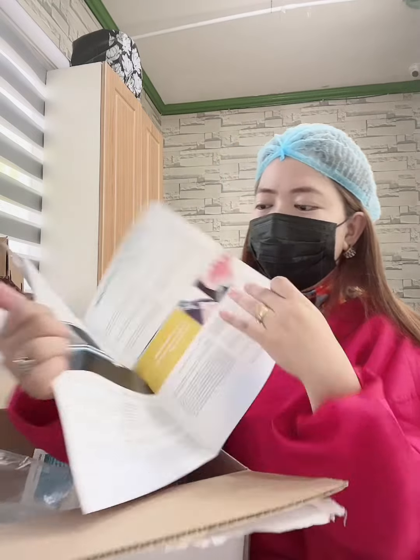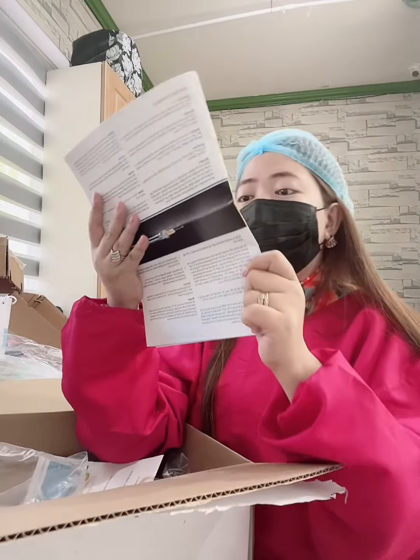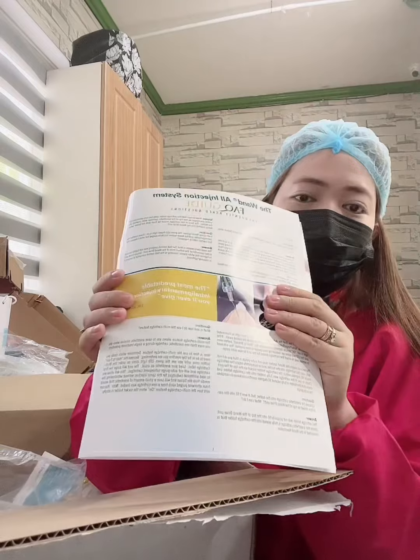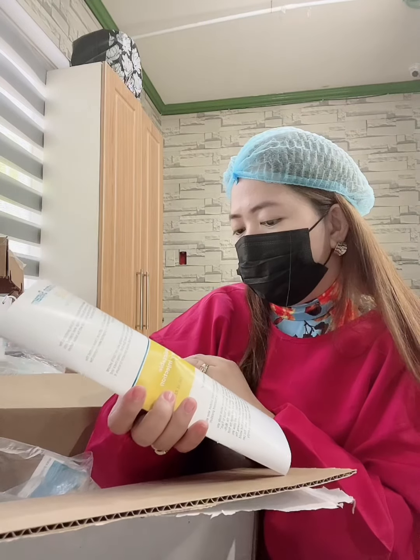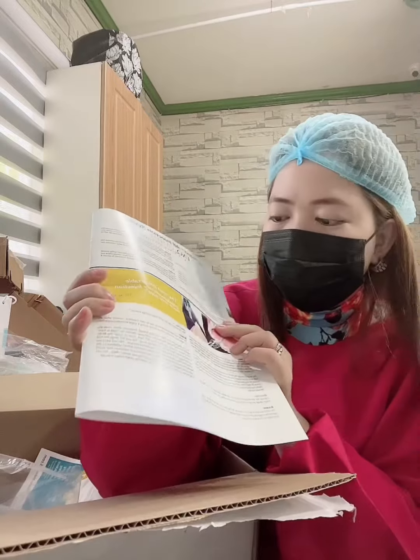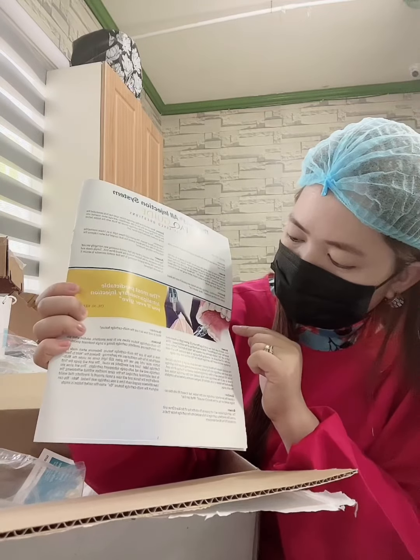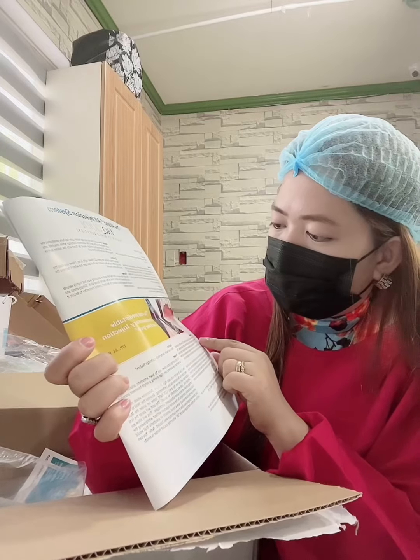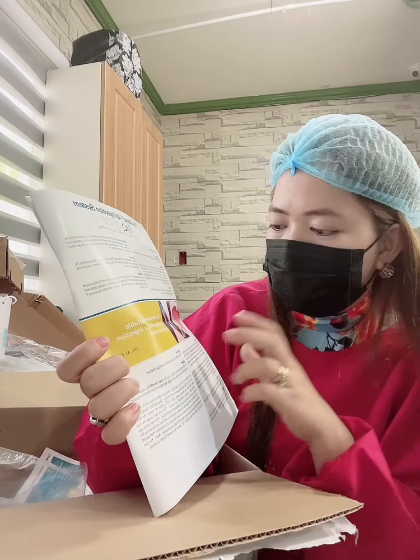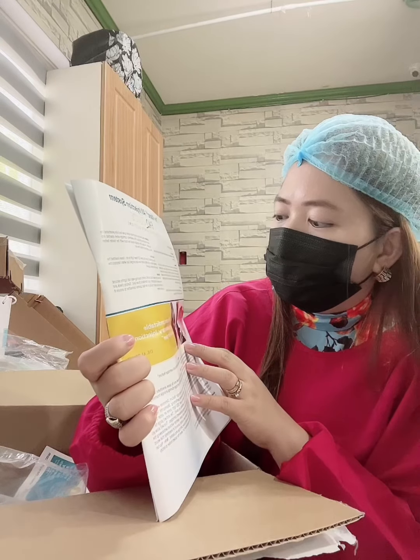Come on, let's attach it. Good luck! I'll try this. The good thing about this, guys, is that we give an intraligamentary injection. We insert it through the periodontal ligament, in between the tooth and the bone, so there is very little pain. And then there is no pressure felt during deposit of the anesthesia itself.